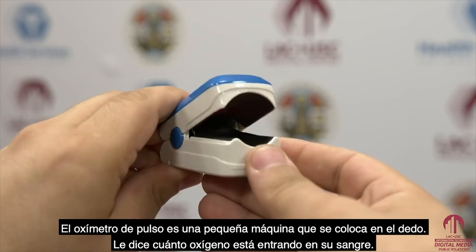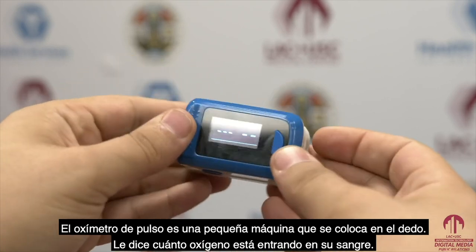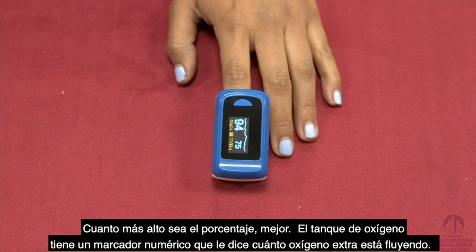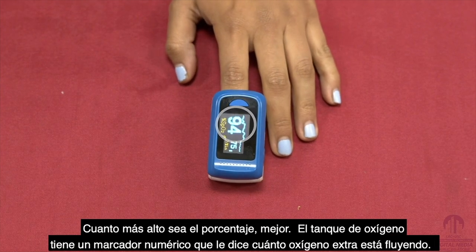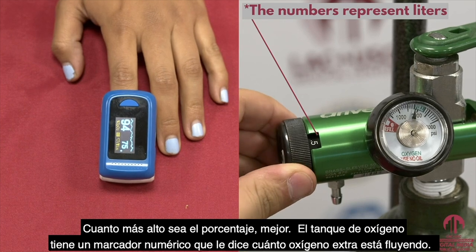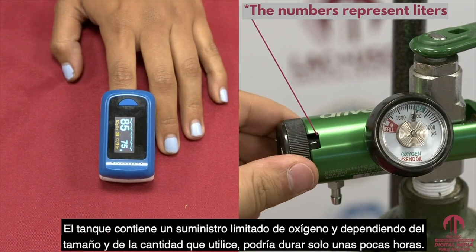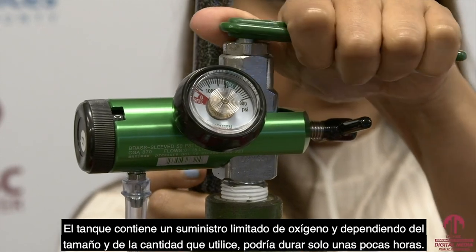The pulse oximeter is a small machine you put on your finger. It tells you how much oxygen is going into your blood. The higher the percentage, the better. The oxygen tank has a number dial that tells you how much extra oxygen is flowing. The higher the number, the more oxygen is being released.